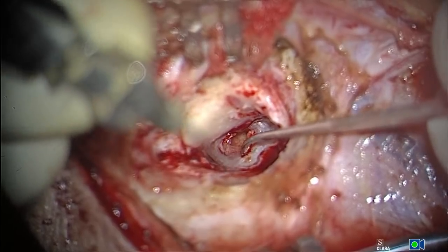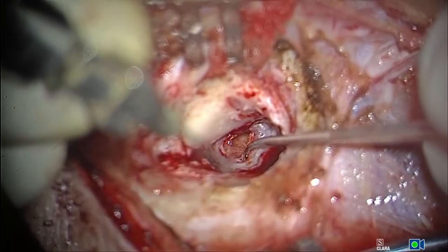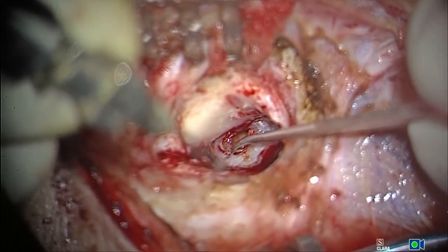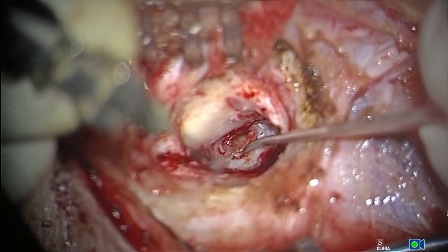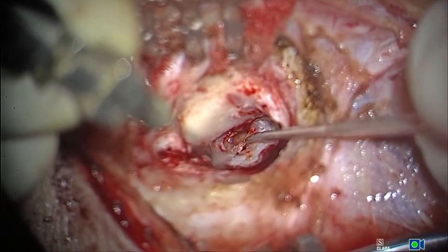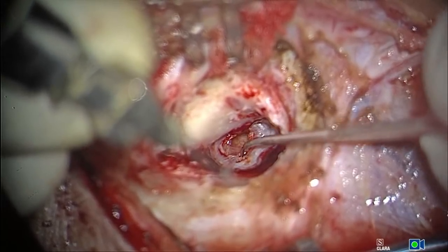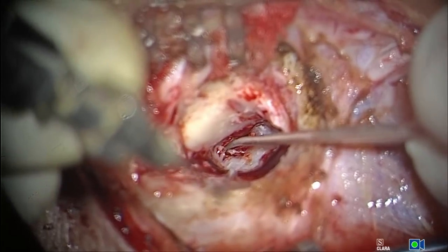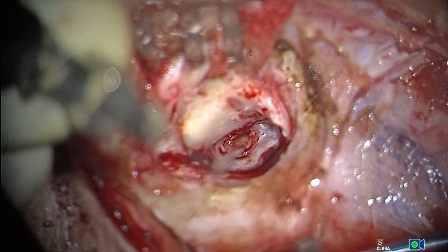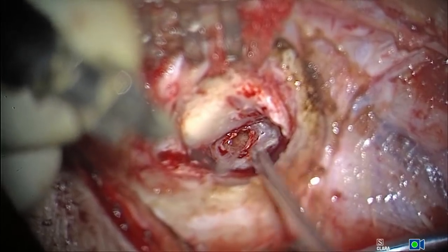Okay, that's perfect. Give me a scissors now. Micro scissors. So posteriorly I don't mind taking more of the flap, but anteriorly I'm very conservative about the flap length, as I told you, because that is very important for me.